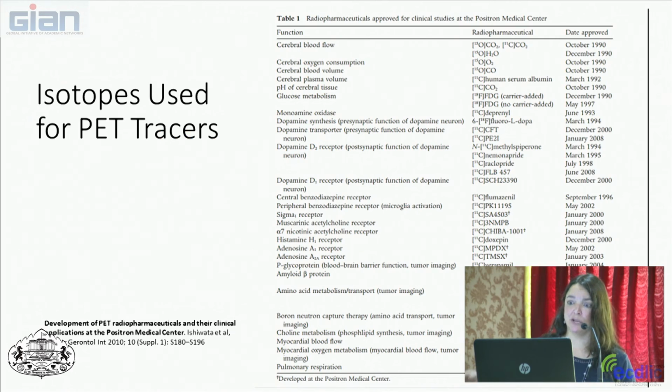There are a number of PET tracers other than FDG that are currently being used. A lot of these are research tracers. So a lot of these are newer, or you have people that sit around and think about these tracers a lot and try to make new ones and try to characterize different types of metabolisms or things that can be labeled in the body using these tracers.